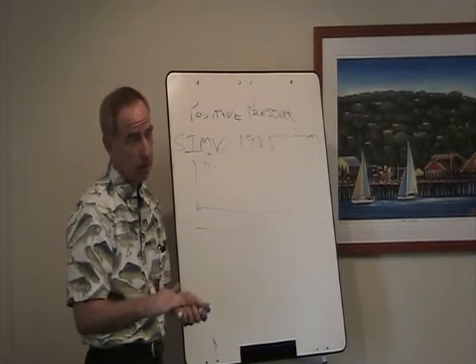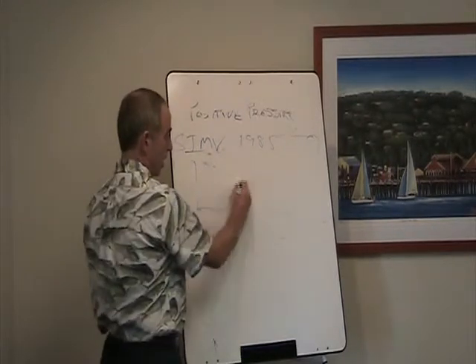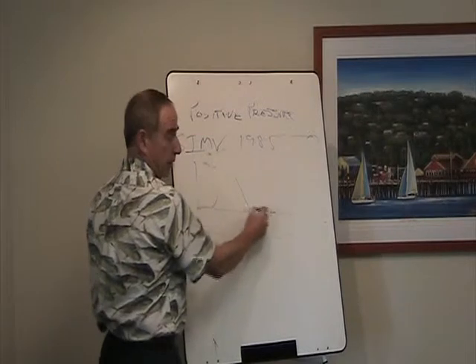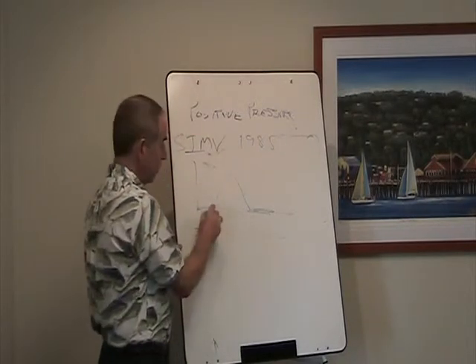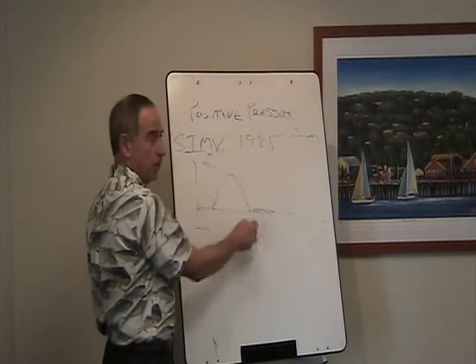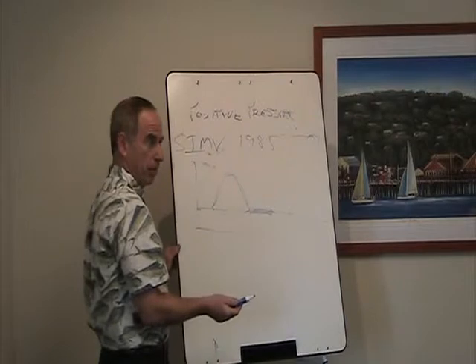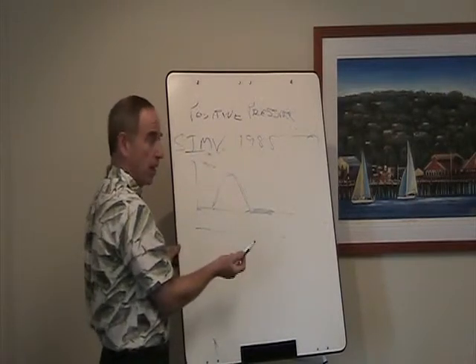If they're getting mechanical breaths, then it's only at end expiration that they maintain that pressure. During the breath, they're not at the CPAP level or the PEEP level, right? They're at much higher pressure than that. But at the end, they're at that PEEP level. So it's really the same.